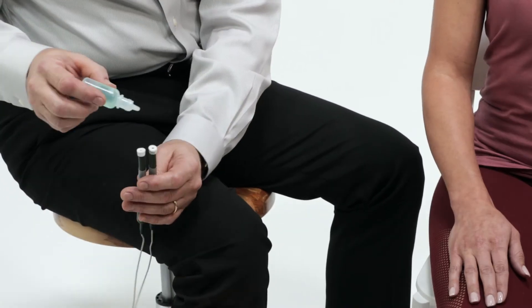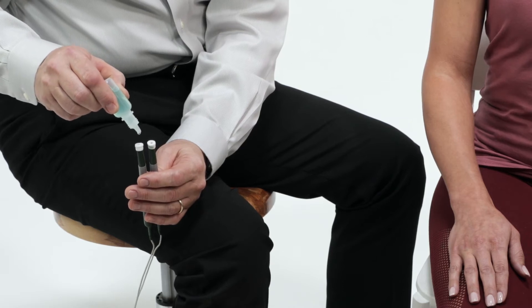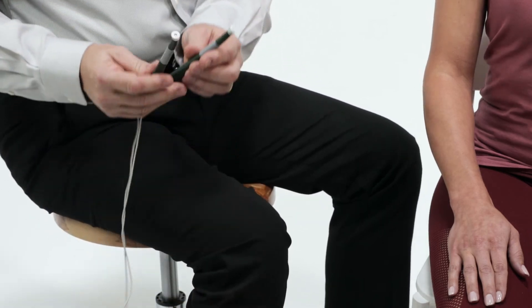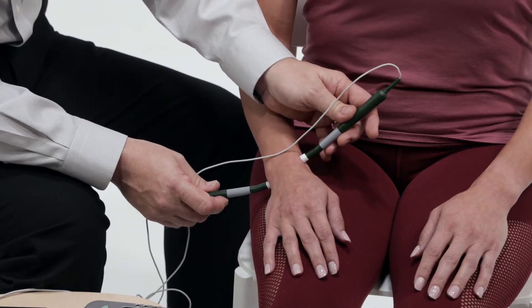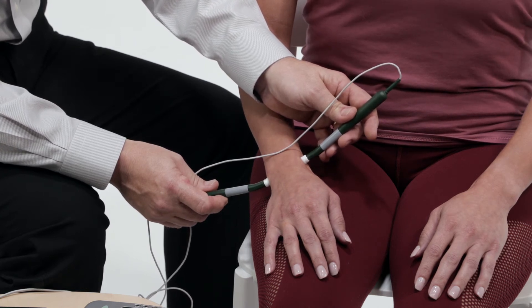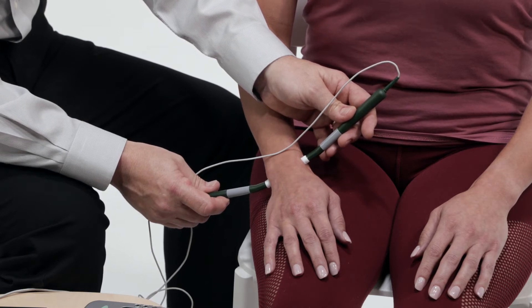Saturate PEPs thoroughly with several drops of conducting solution. Repeat as necessary through treatment if probe pads become dry. Press smart probes on clean, dry skin. The timer cycle will start with two beeps when the skin is contacted and end with a single beep. Hold probes firmly against skin for the entire 10-second cycle before moving to the next treatment location.